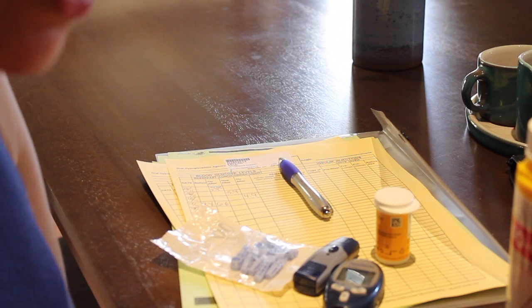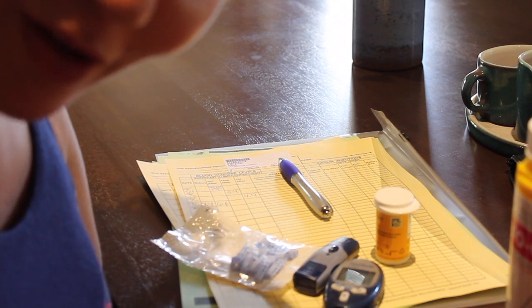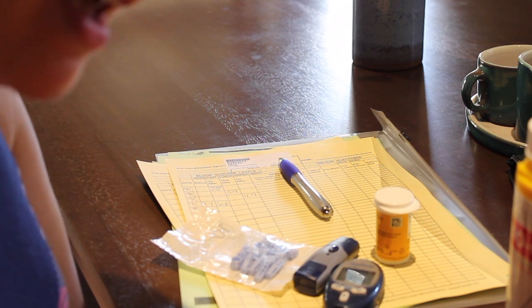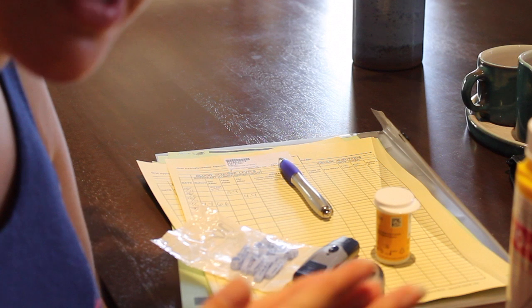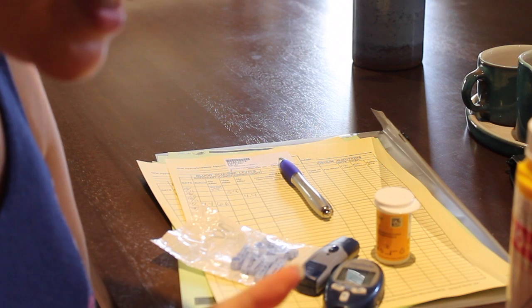Once your hands are completely dry, a trick I just learned from my sister-in-law, who had GD recently before she gave birth to her baby, totally fine now, is that you do want to have your hands warm. Now, I generally have cold hands, and that means my circulation is not the greatest.